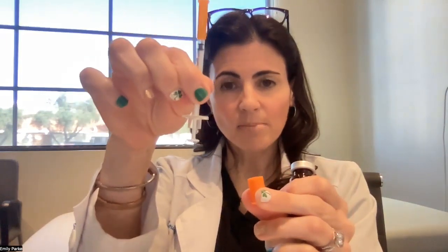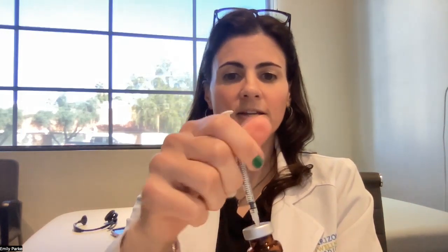Then you're going to want to open your syringe. You're going to want to take off the cap that's at the bottom, and also remove the cap where the needle is. Then you're going to put the syringe with the needle into the vial like this.